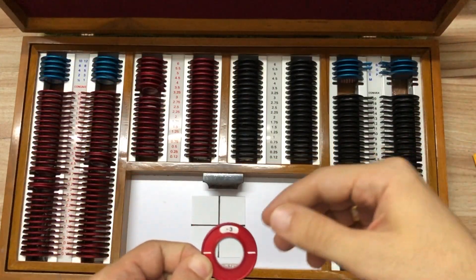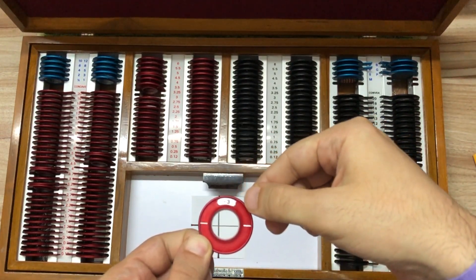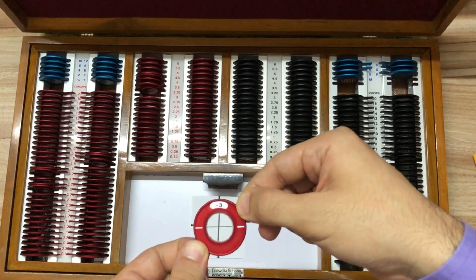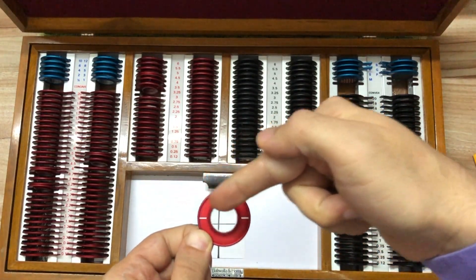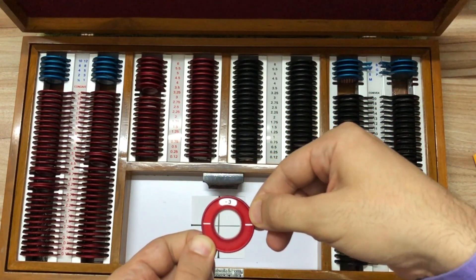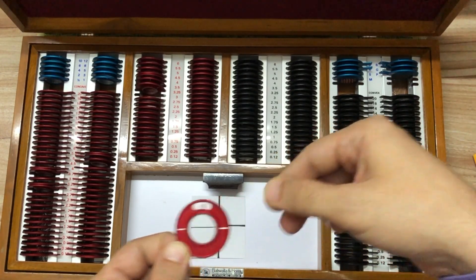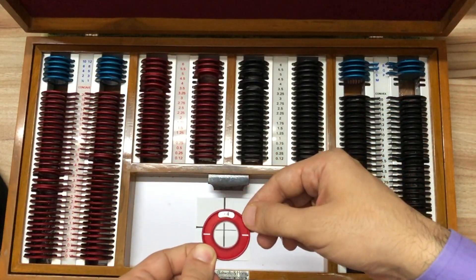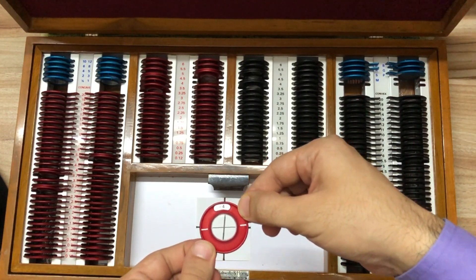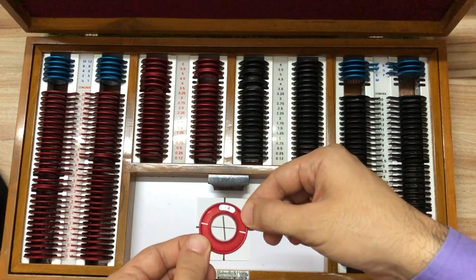In the case of cylindrical lenses, there will be different movements in the two meridians. If it is a minus powered cylinder, the image will be minified and will move in the same direction as the spectacle when moved along the meridian that has power. When moved in the direction of the other meridian, there is no movement because there is no power in that meridian. Another typical feature of a cylindrical lens is that when it is rotated clockwise or anti-clockwise, the image — in this case a cross — appears to move like a scissor, giving us a scissor reflex.